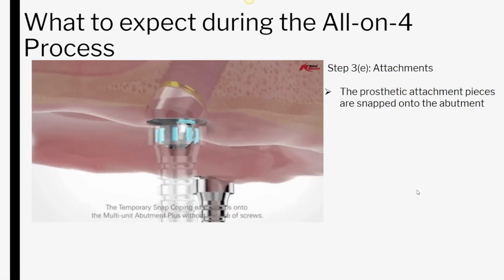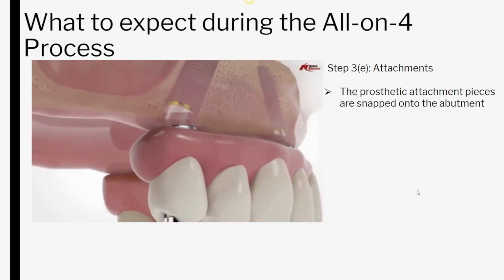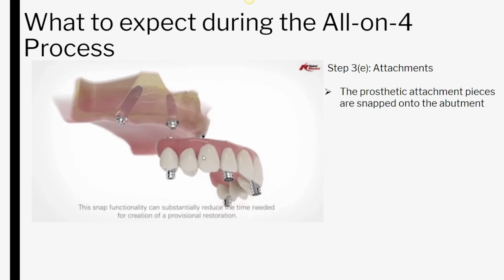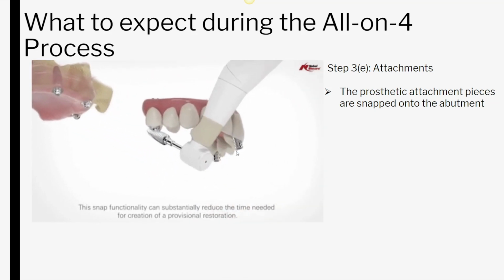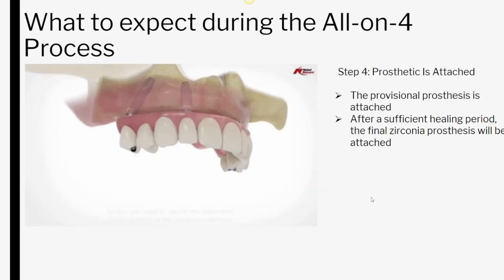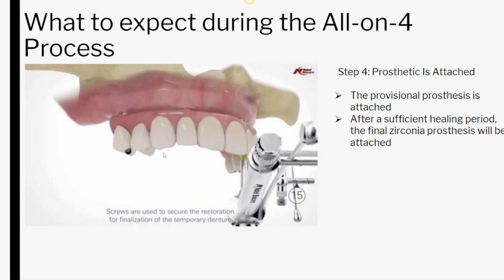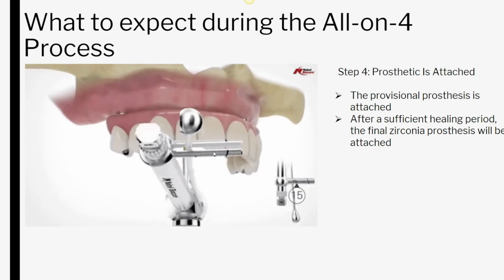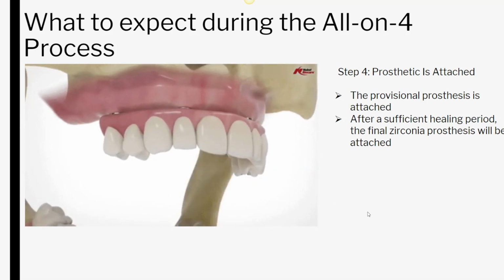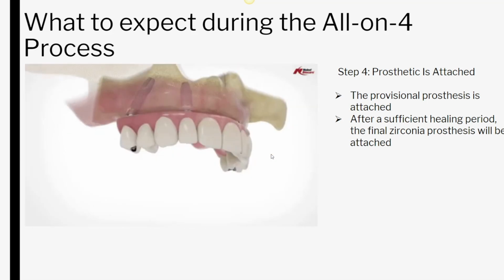This is all done the same day as your implant surgery so that you, again, can go home with teeth in your mouth. Again, this process is called the conversion process, upon which the cylinders go on top of the multi-unit abutments, and then the prosthesis goes on top of the cylinders. Finally, what we do is we use the prosthetic screws and we screw this prosthesis in place. So just to let you know, when you go home that day, you're going home in an acrylic prosthesis that we want you to wear for 4 months while you're healing.